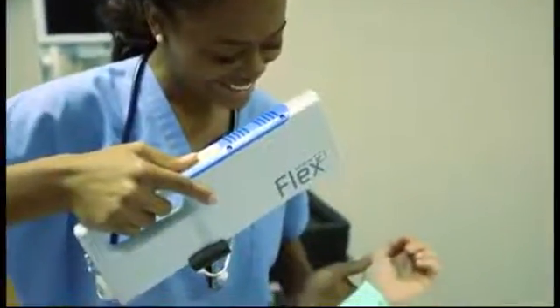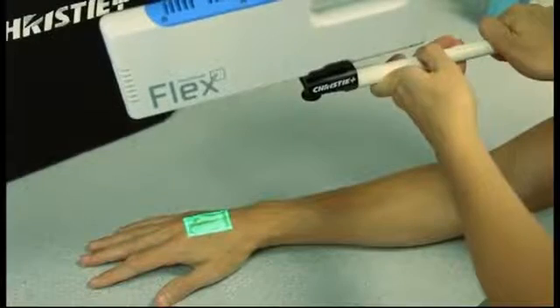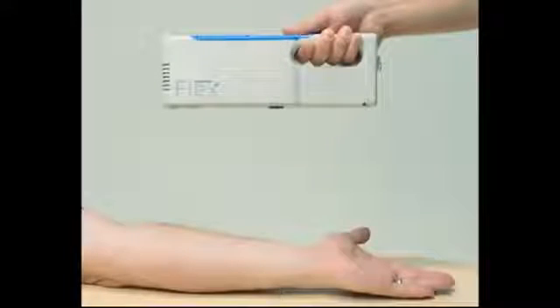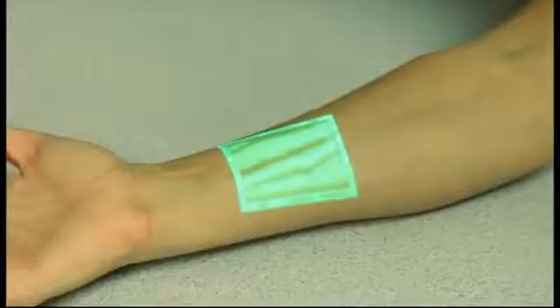VainViewer Flex is simple to focus and use. The proper focal distance is 12 inches or 30 centimeters from the surface of the skin. Flex should be held as close to perpendicular or 90 degrees to the surface as possible. Once perpendicular, rotate the device in any horizontal orientation and maintain image quality.